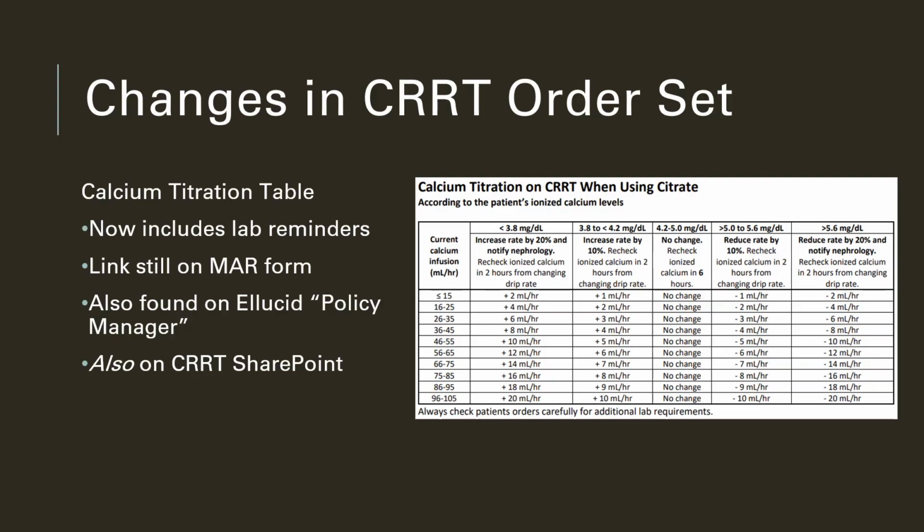This minor update was made because of incident reports where nurses had neglected to get ionized calcium levels throughout their shift, and so this was supposed to make it a little bit easier. The link is still on the MAR form. It's a little bit longer now, but it's the same overall link.